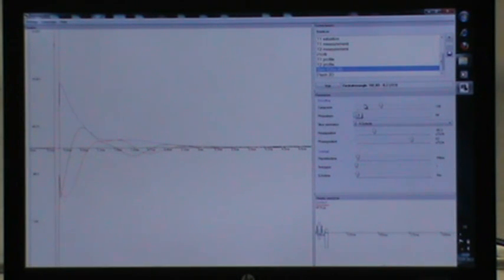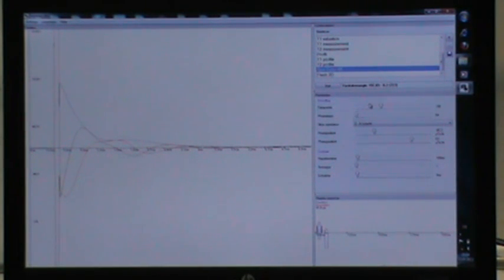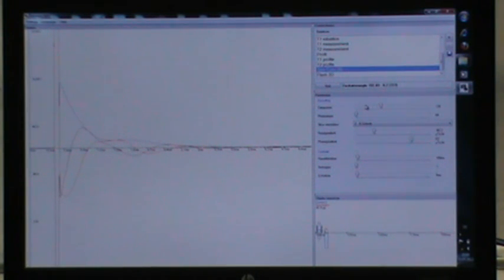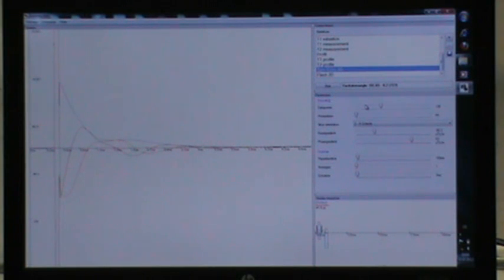Note that the number of phase steps essentially determine the measurement duration. Now, select the slice orientation. In our example, we will take the XZ slice.